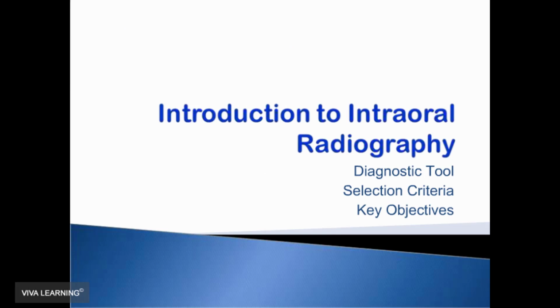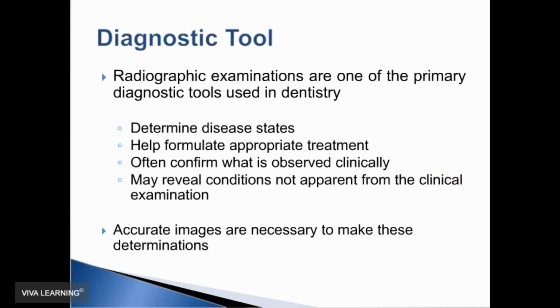We're going to do just a brief overview of intraoral radiography. As you all know, we couldn't really practice dentistry without radiographic imaging. They're one of the primary tools in dental diagnostics, and we need them to determine disease states, to help develop informed treatment plans, and to confirm often what we suspect clinically when we examine the patient.